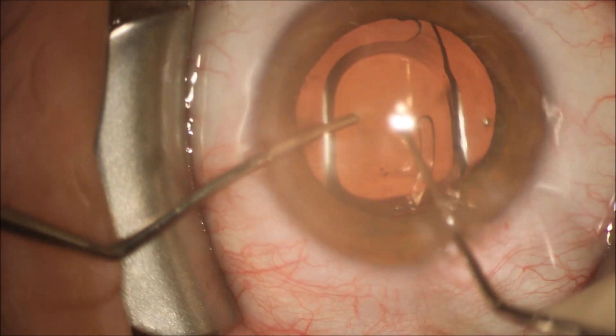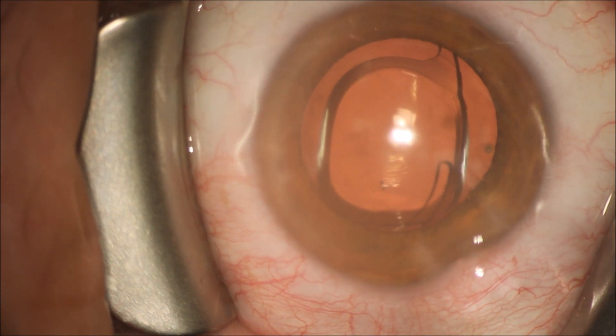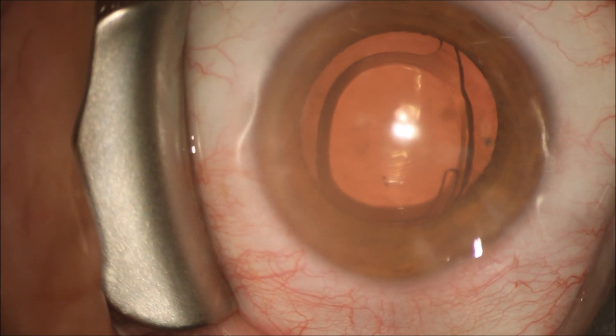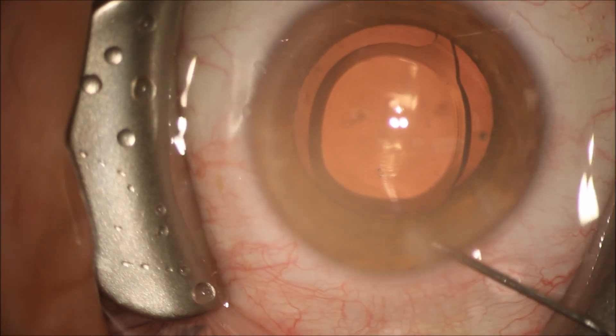We're helping the lens unfold with two instruments, flattening the lens out from the position it assumed sitting in the little injector cartridge during the case. You can see the lens is already centering well.